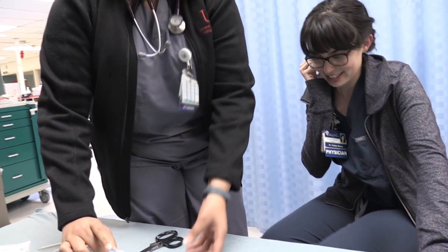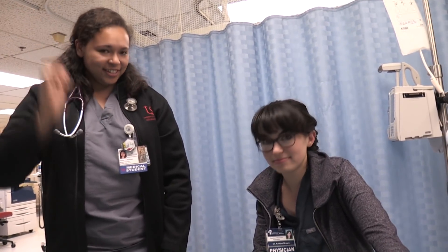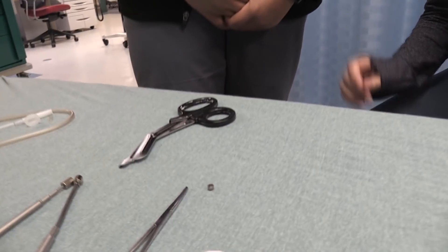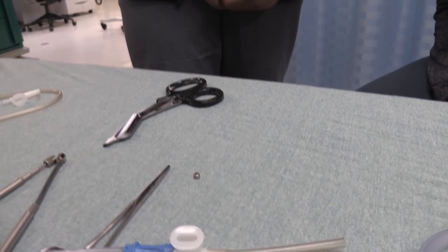You got it. It felt like it was trying to suck out my whole ear. So we actually demonstrated that these suction catheters can remove rounded, relatively rounded foreign bodies. If you look closely at the hearing aid battery, it's kind of a flat round object — but it worked.